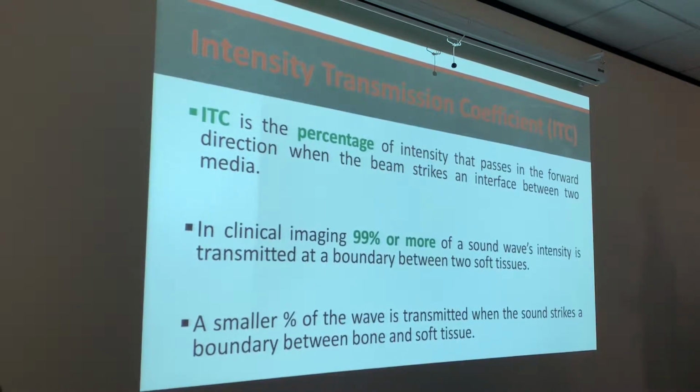They always call that the black streak on your screen, right? That's because you're getting hit in the anterior part of the near field, and everything posterior to that is going to be black because the rib absorbed all of that sound. Why on other images does bone show up as white? That's the reflection, because that's the difference in impedance between the soft tissue and the bone.